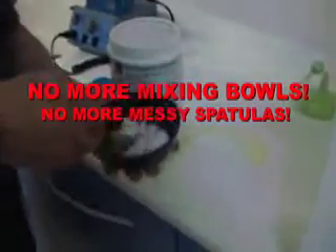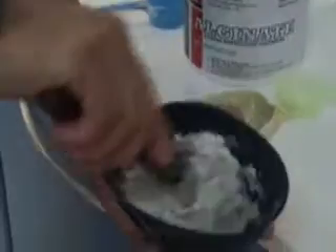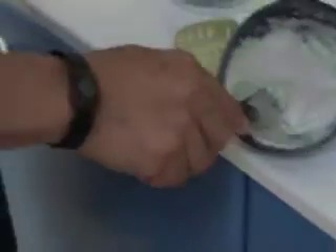No more untidy mixing bowls. No more inconsistent alginate. No more tired wrists from mixing. Stop wasting your valuable time.